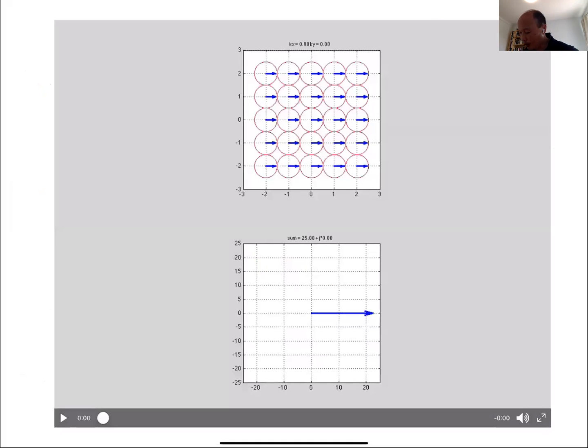And this movie here, let's see, what is it showing? I think this is just showing different spatial patterns and then assuming a uniform object. We're showing that the K-space value is largest here, at the center of K-space, and anywhere else we go off in K-space, the other spatial patterns give you a very small value for the Fourier transform, because for a uniform object, the best match is when all the spins are pointing in the same direction.